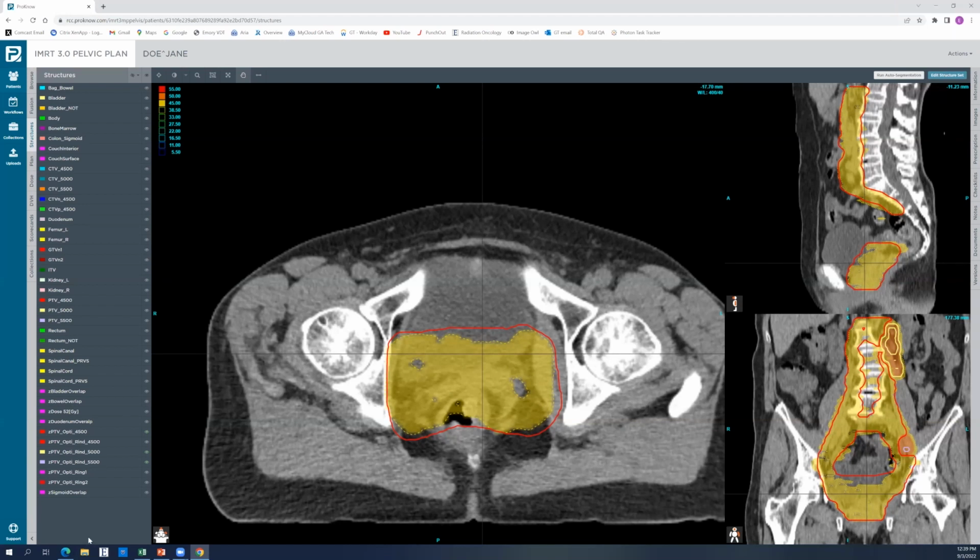Now, my second question is about the organs at risk. When you're creating that, is it advisable to create a secondary organ, let's say bladder, for the part which hasn't closed in on the PTV region? Is it advisable to crop to get a secondary organ by cropping the area that is not infiltrated by the PTV? You would use that, like the bladder that's not overlapping with the PTV, to help your mean dose. Yes, because I remember in one of my earlier trainings, you crop the area, and that's what I did in my plan. Okay, yeah, that would be very useful.